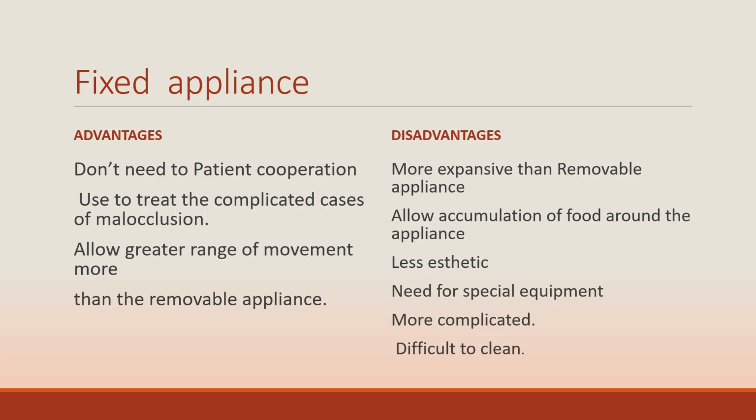And advantages of fixed appliances: they don't need patient cooperation, and they are used to treat complicated cases of malocclusion which we cannot treat by removable appliances. They allow a greater range of movement than removable appliances. And disadvantages, of course, they are more expensive than removable appliances.